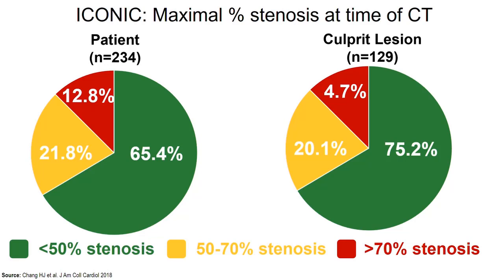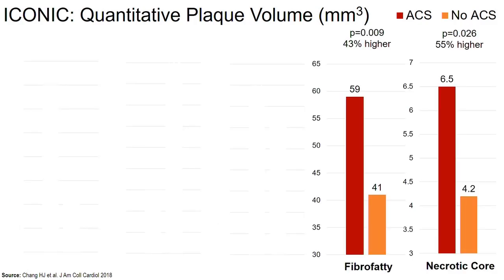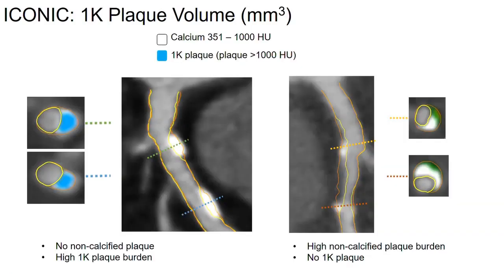So then at this point in time, the hypothesis was that it must all be about atherosclerosis, right? Which it was not. When you looked at the total plaque volume between the patients who experienced ACS versus those who did not, they did not differ at all by total atheroma volume, they didn't differ by calcified plaque volume, and they didn't differ by fibrous plaque volume. Instead, the only differences that you saw between the cases and the controls, of those patients who would experience acute myocardial infarction after a CT, is in this whole fibrofatty and the necrotic core plaque composition. And then it goes back, it reverts the other way too.